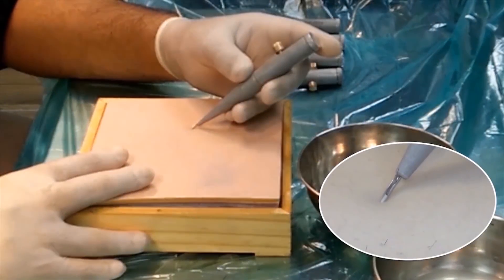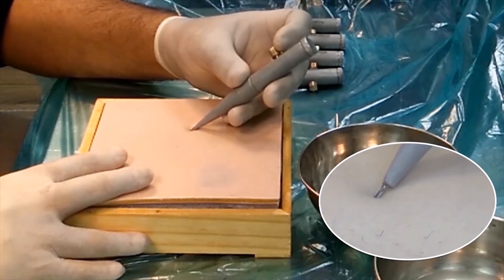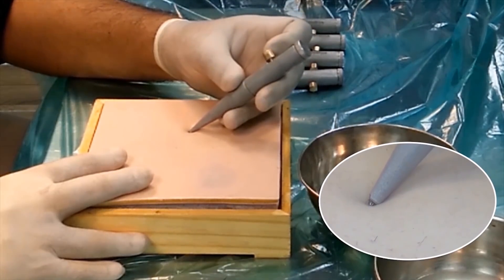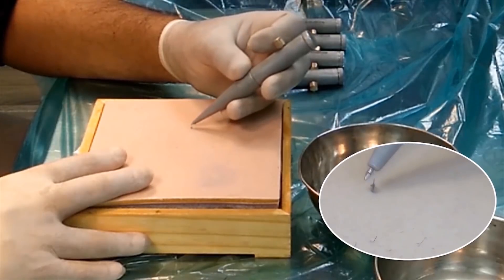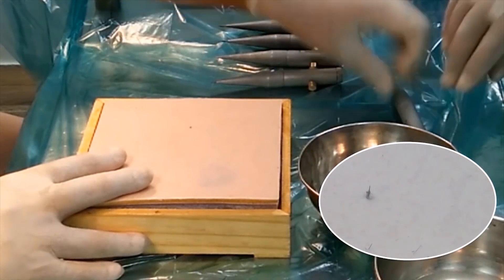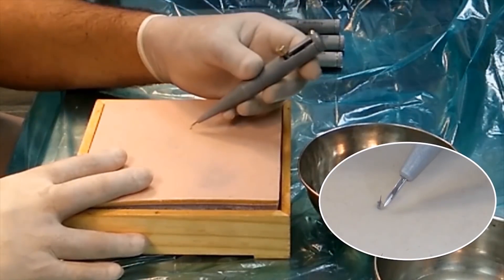The graft implantation process. Simply insert the entire length of the needle into the skin, with the upper end of the graft still lying above the skin. Now simply release the lock of the plunger and slowly withdraw the pen. The graft will be securely placed in the skin. With this pen, anyone with no experience in hair transplant can also do the implantation with absolute ease.